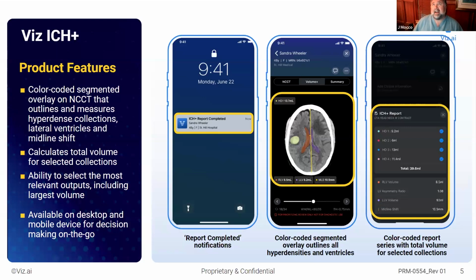Well, I don't know about Get With The Guidelines specifically, but absolutely, the ability to have everything coming through Viz allows us to screen through that. And we've also used Viz to increase our research enrollments. By using Viz to screen for ICHs, we're able to identify them more quickly. So for instance, for the FASTEST trial, which we're part of, a trial out of StrokeNet, or for a number of our LVO trials, we find the use of Viz helps us be better at enrolling time-dependent trials. That we've seen for sure.